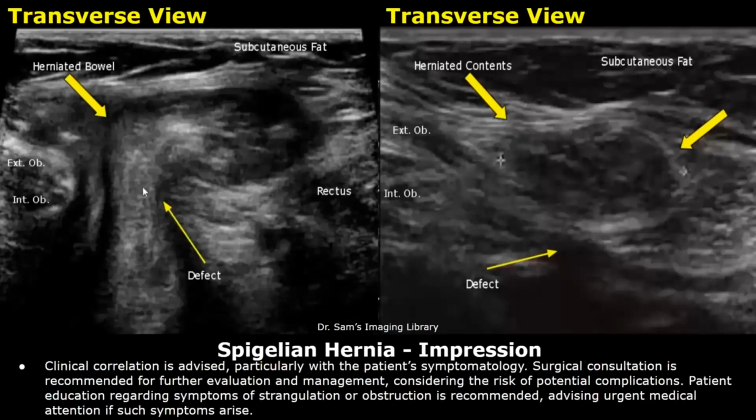This is the continuation of the impression. Clinical correlation is advised, particularly with the patient's symptomatology. Surgical consultation is recommended for further evaluation and management, considering the risk of potential complications. Patient education regarding symptoms of strangulation or obstruction is recommended, advising urgent medical attention if such symptoms arise.